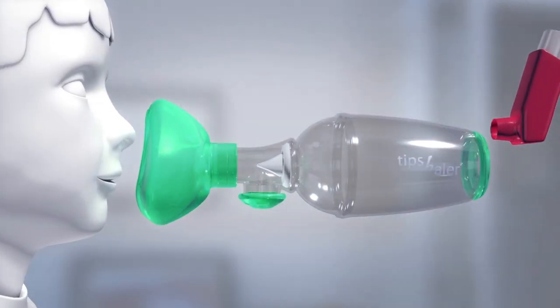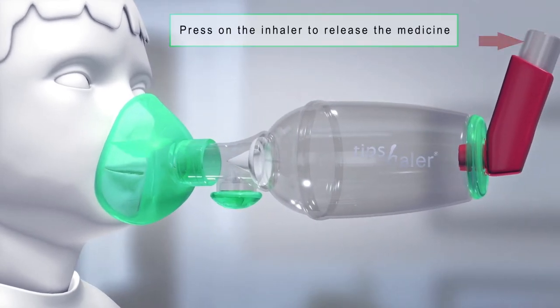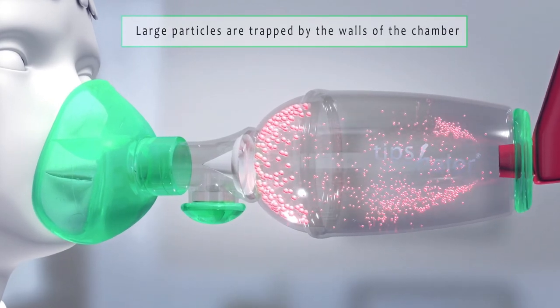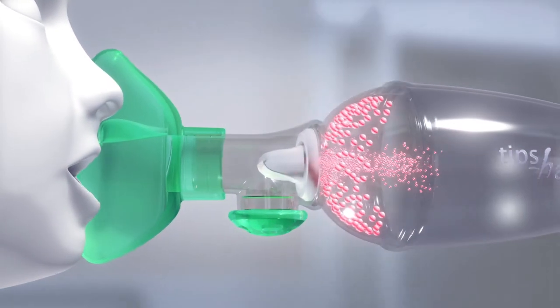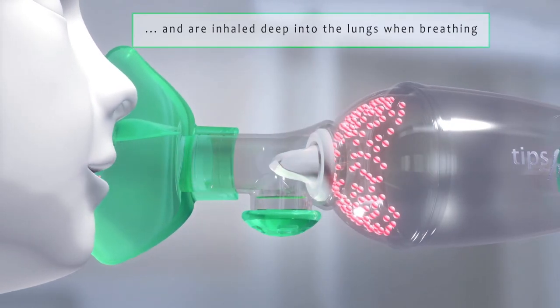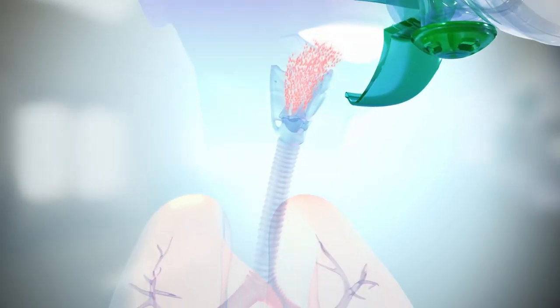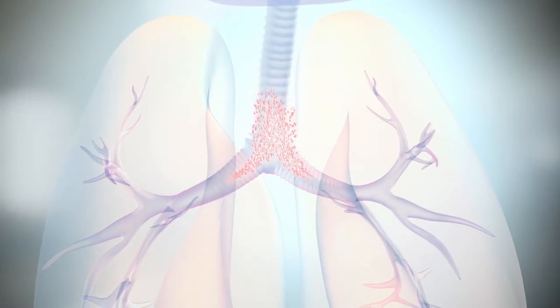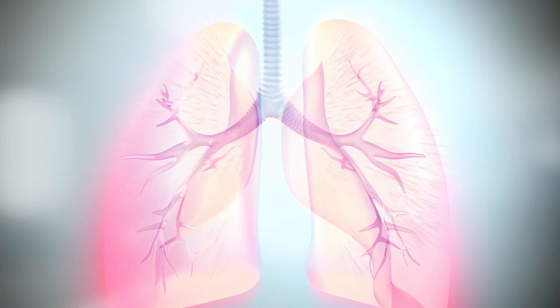The metered dose inhaler releases drug particles in the valved holding chamber in aerosol form. Thanks to its material, TIPS-HALER walls quickly catch large particles, allowing the thinnest particles to remain suspended in the valved holding chamber. Thanks to its partition, pediatric mask ORHOL prevents drug deposit in the nose during inhalation. Small particles can thus deposit deep into the lung, where their efficiency will be maximum.